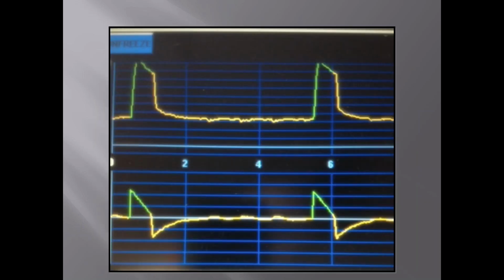So I went to investigate further, and when I put my hand on the patient's chest, it was a patient with cardiomyopathy, and I noticed that the precordium was pretty dynamic, and every time I felt a heartbeat on the chest, you could see those little perturbations on the flow waveform. So there was some sort of dynamic cardiac activity that was actually triggering the ventilator.